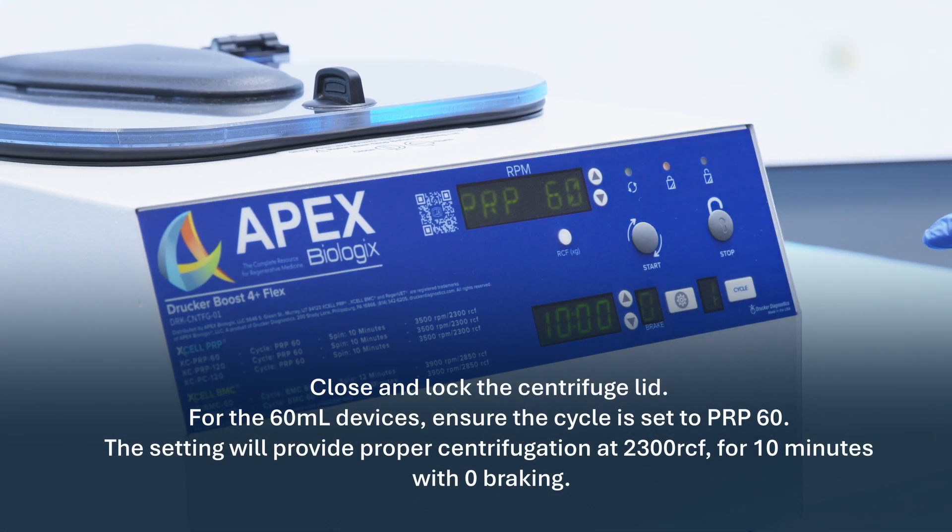Close and lock the centrifuge lid. For the 60 milliliter devices, ensure the cycle is set to PRP 60. The setting will provide proper centrifugation at 2,300 RCF for 10 minutes with zero braking.